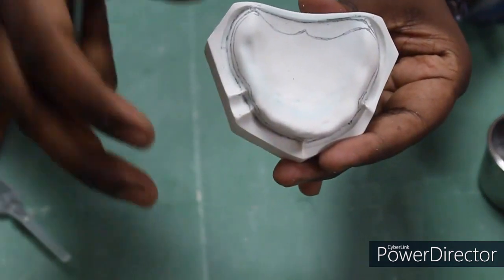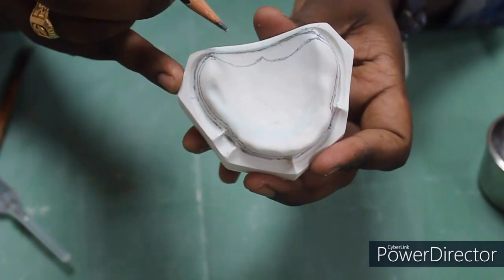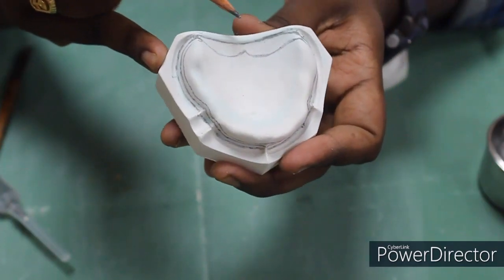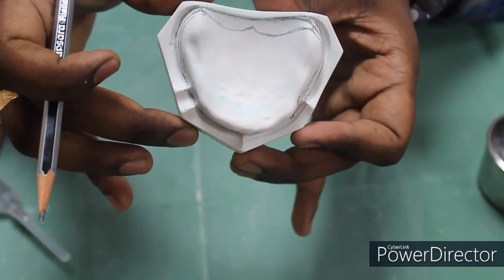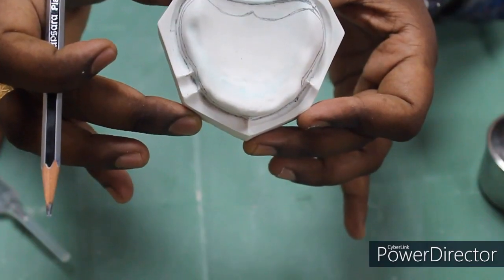Now you can clearly notice this. We have extended the anterior vibrating line, that is, a spacer extension correlating to the anterior vibrating line. Why? Because as per Boucher's recommendation, we have to expose the posterior palatal seal area, so that it will act as a guiding stop for the positioning of the tray.